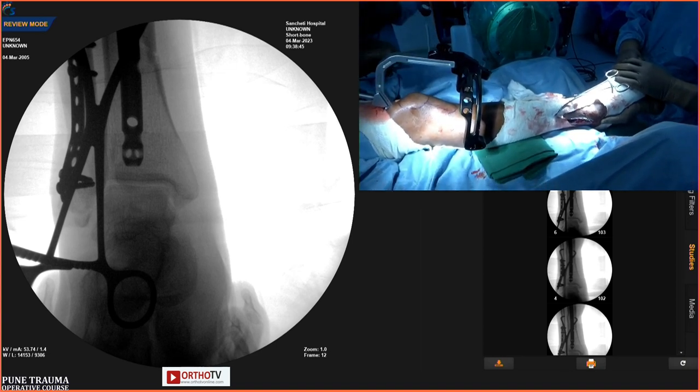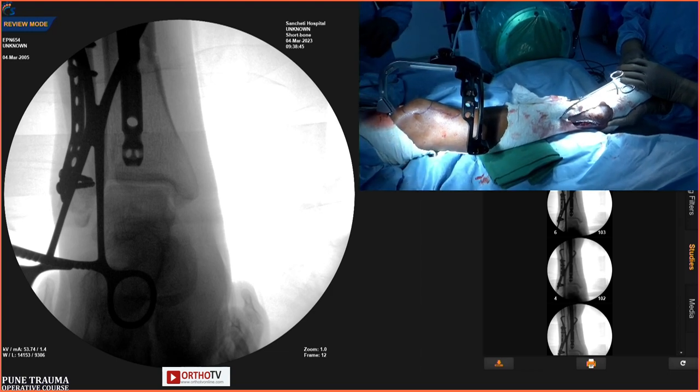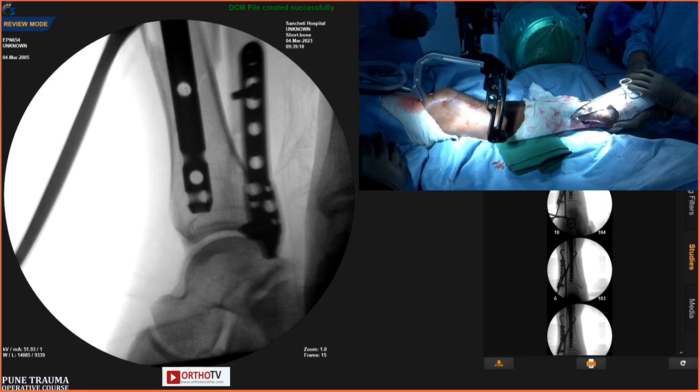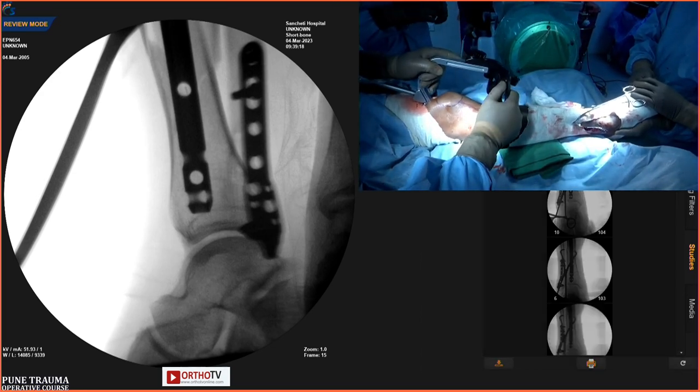It is just now a routine locking that is done. Distally, we'll do three locking, and proximally, you can see here how it is. There is some work. So demonstrate locking here.